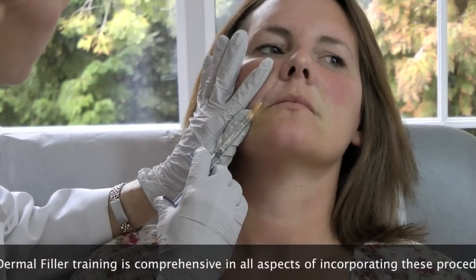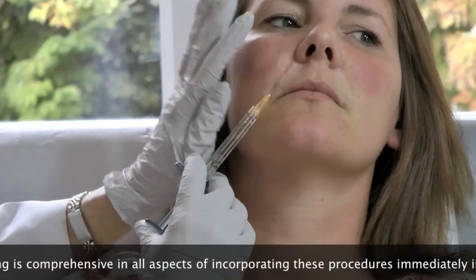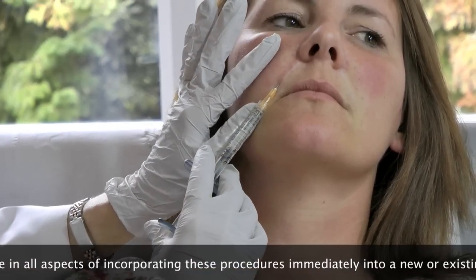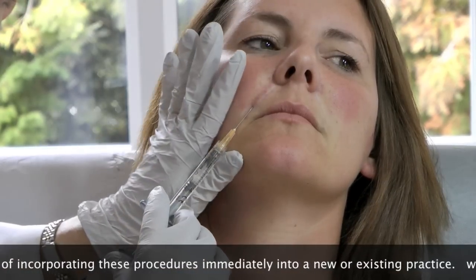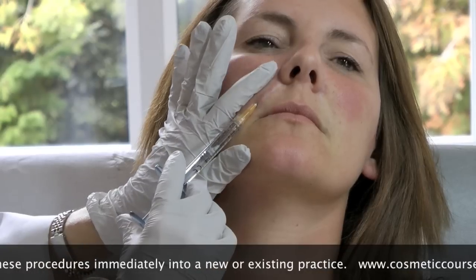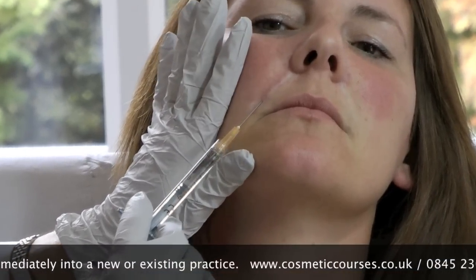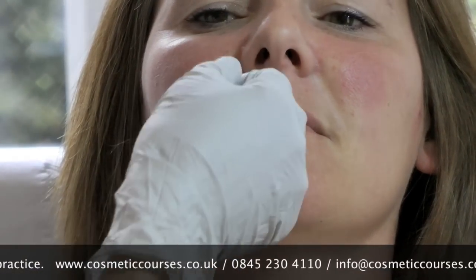And slowly withdraw, so the top bit takes a bit more. So you can see we're at that point there. Stop injecting just before we come out — you'll see it's instantly come out. And then we'll just do some massage at the top.